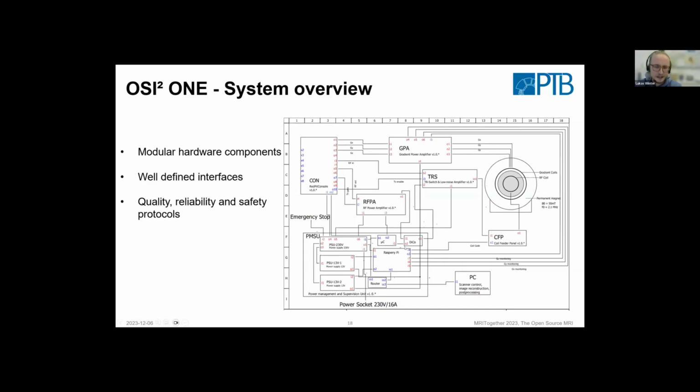And then having this in there includes also having log files of knowing which system components the system currently has. That can be then transmitted to the external software that actually runs or defines the pulse sequences, does the image reconstruction, etc. that needs this information. And that's also how we can work better together when there are bugs, etc. If you just send log files and you know really what your system is containing.